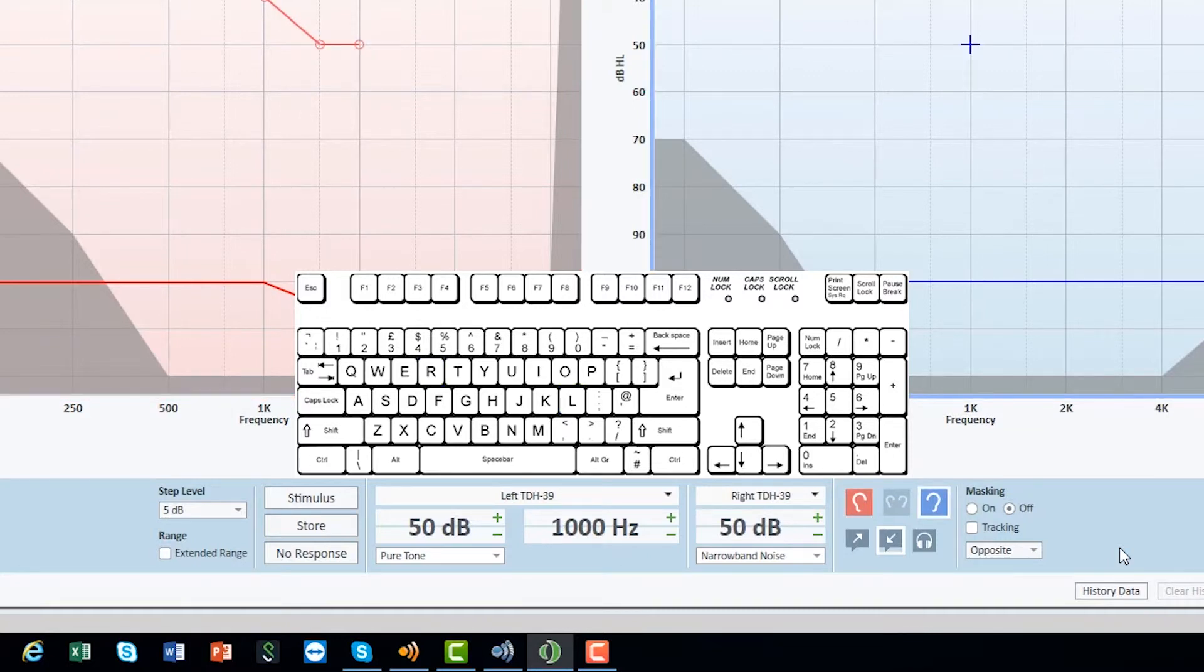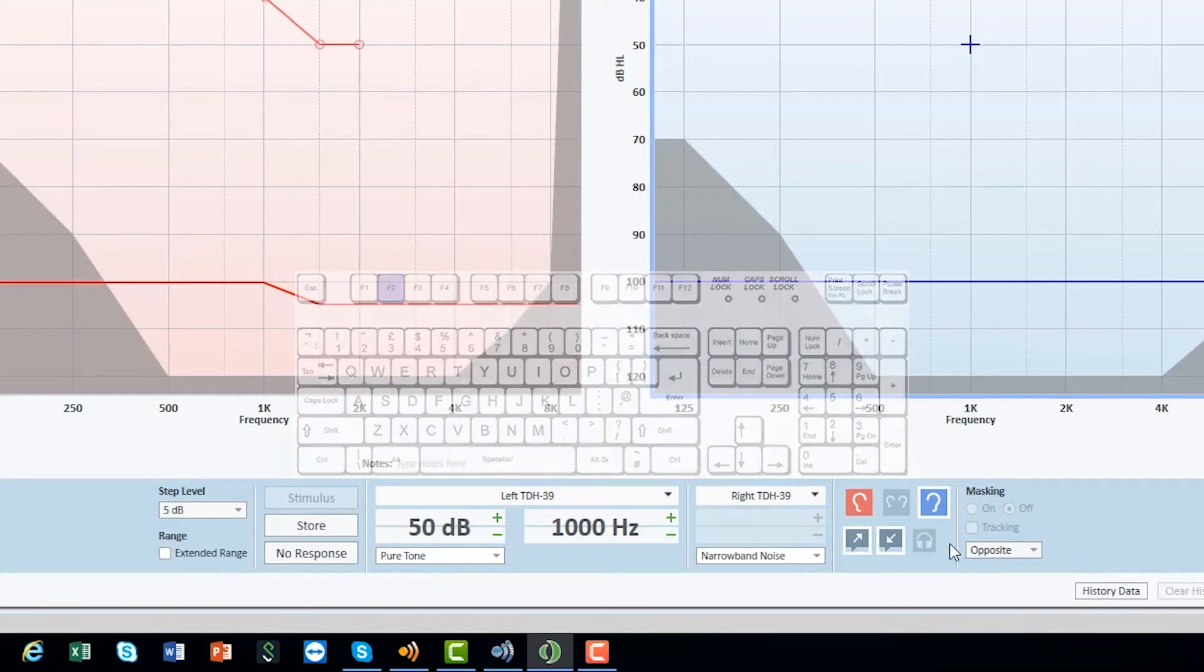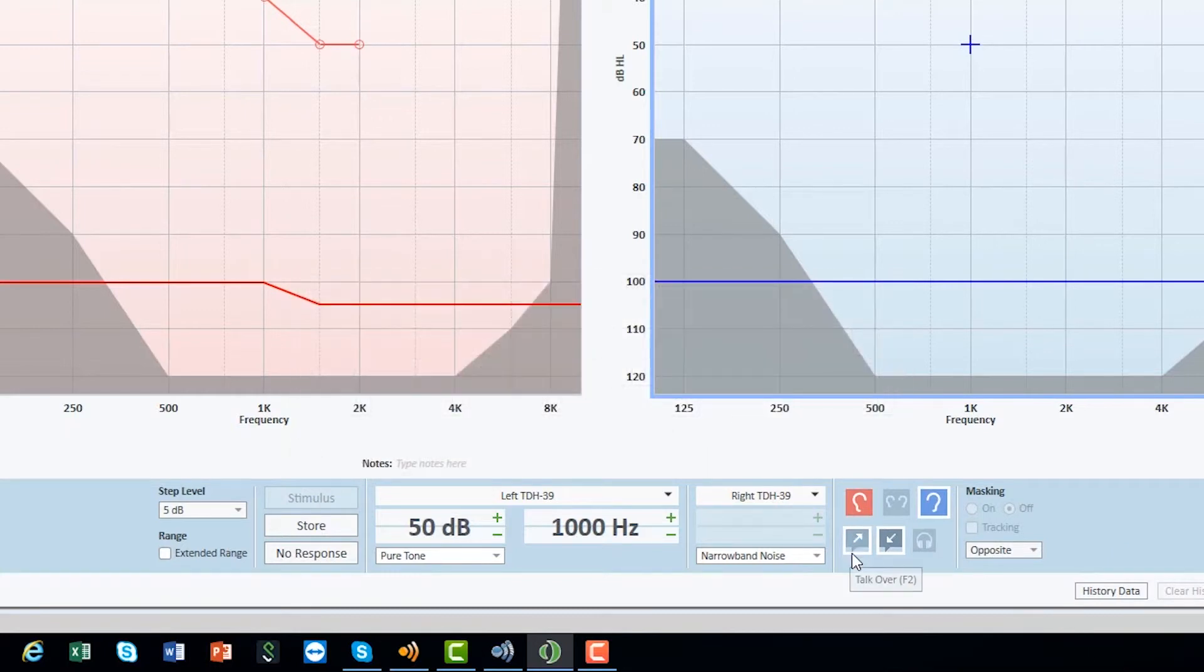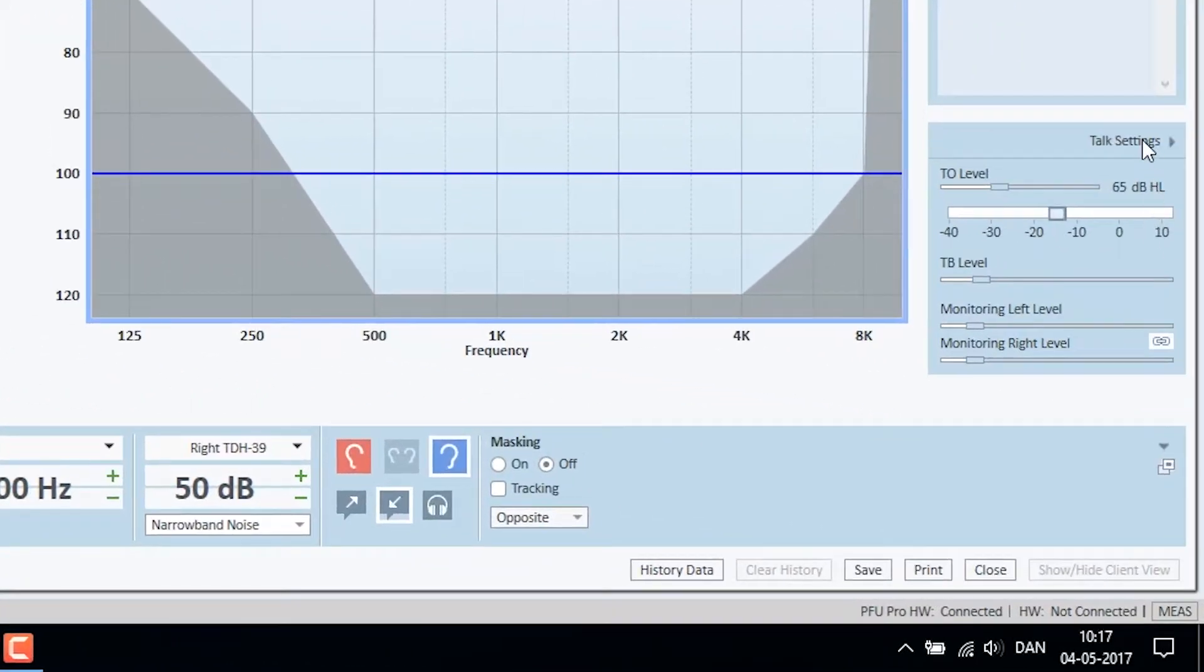To activate the microphone to communicate with a client, use F2 for talk over. The talk over function is indicated in the lower part of the screen. Talk back is always enabled per default, so it is possible to hear the client that is being tested. Level of talk back, talk over and monitoring are found in the talk settings.